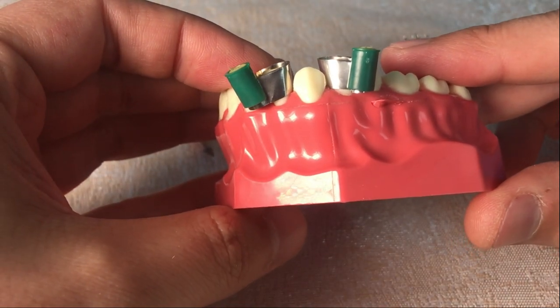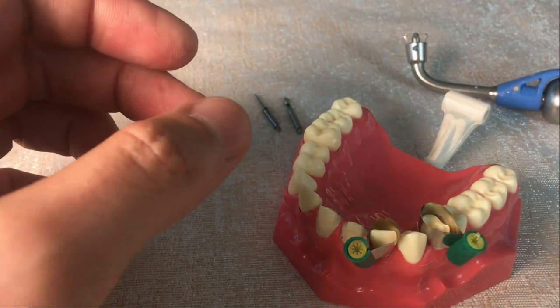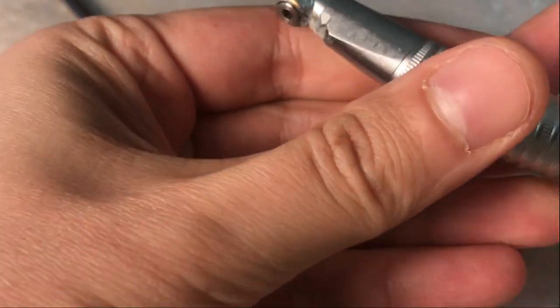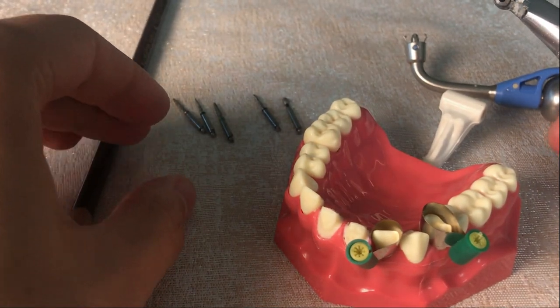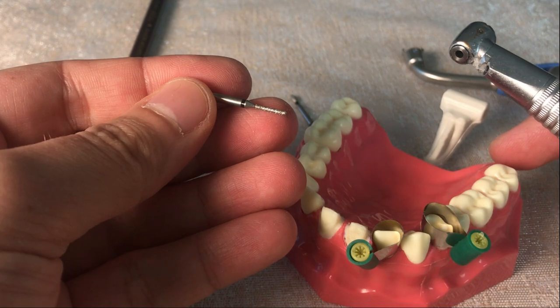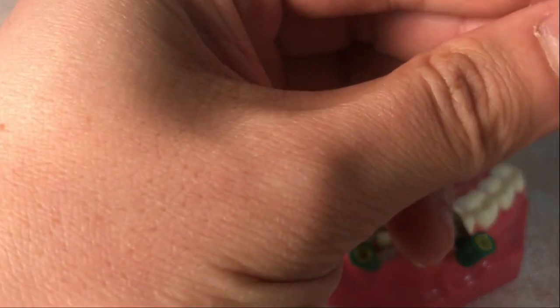Our purpose for using automatrix is to prevent damaging the adjacent teeth while reducing the axial walls. First, I place the matrix bands to the adjacent teeth. Then, I insert a 2 mm cylindrical shoulder burr.